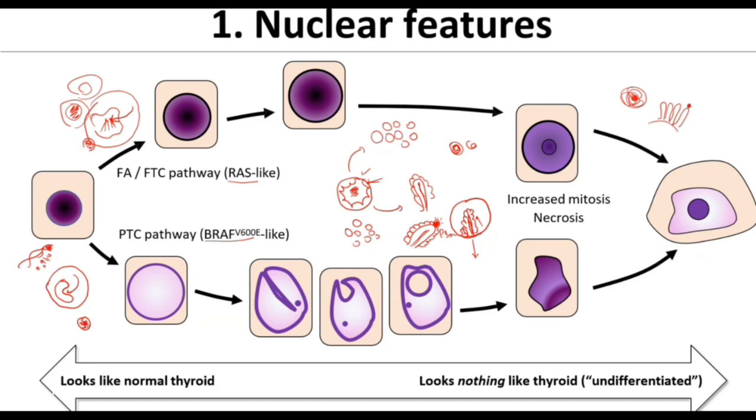That is called an intranuclear inclusion; those are true inclusions. But in thyroid, because the nuclear membrane is lax, the cytoplasm invaginates, leading to pseudo inclusions. So when you observe these inclusions, the nuclear margin will be thickened, and the color of the inclusion will match the color of the cytoplasm.